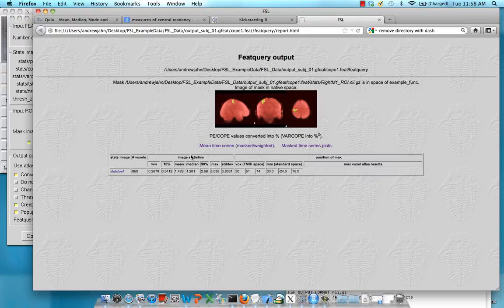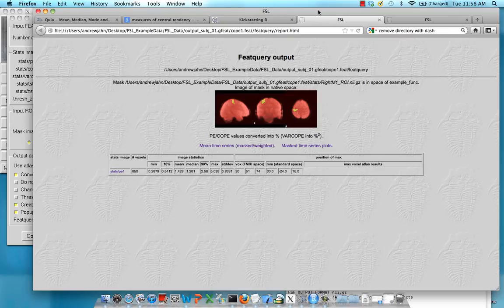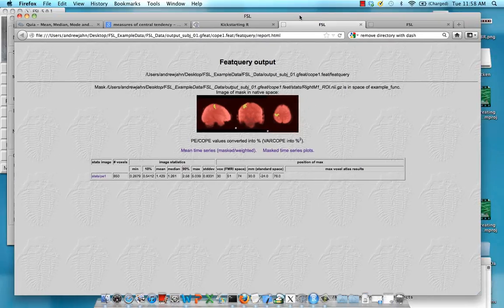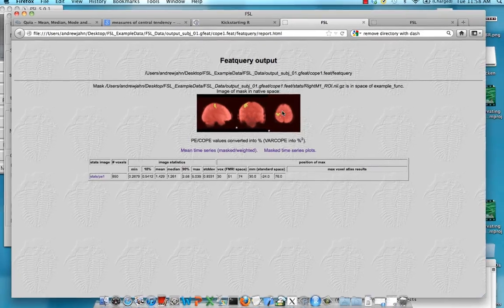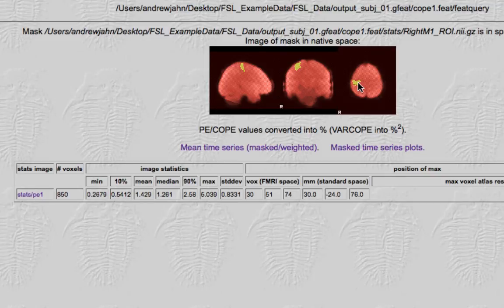And it's generated two separate reports, one for each contrast. So highlighted in yellow is the region of interest that we're extracting data from. This is the right motor cortex.